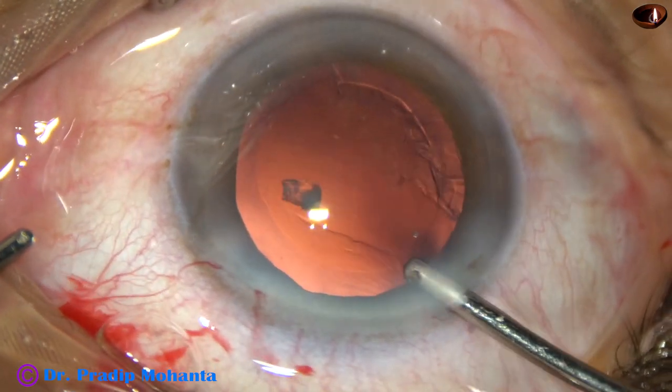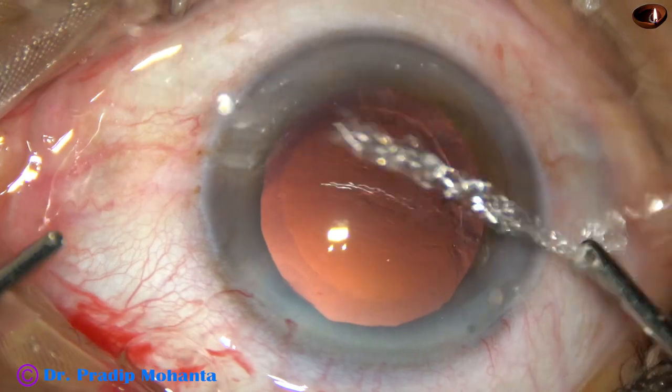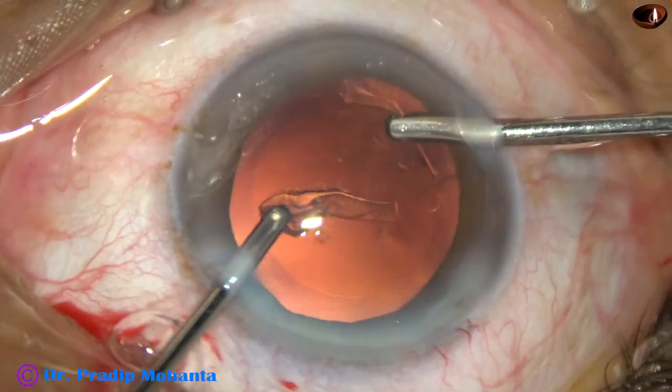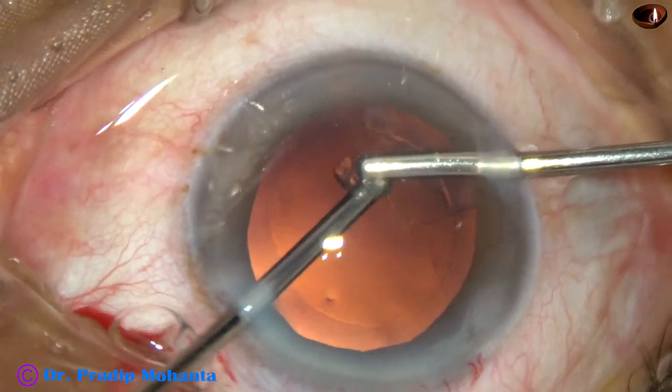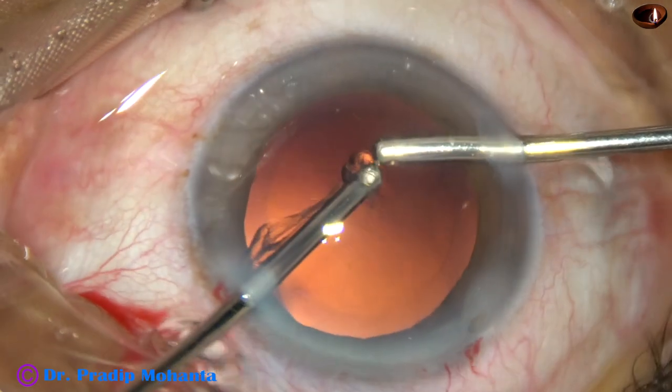Simcoe gives more control on aspiration than this instrument. Now this nuclear bead has to be removed — it is engaged at the main incision and it is brought out. Now the aspiration is from the right side port and the cortical matter from 10 o'clock to 6 o'clock is removed.